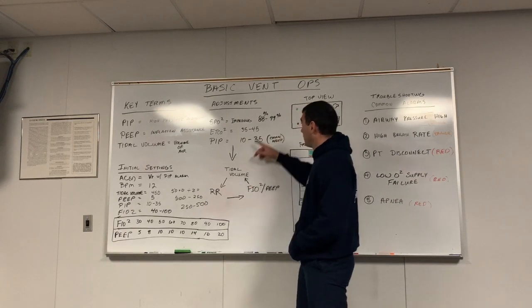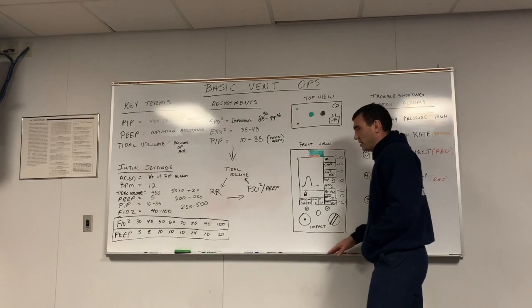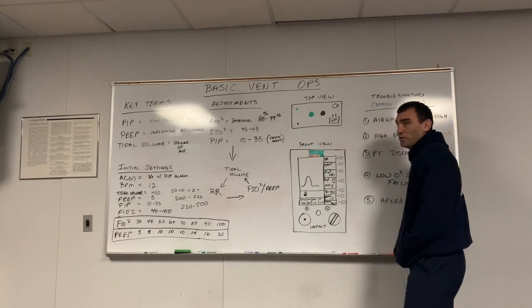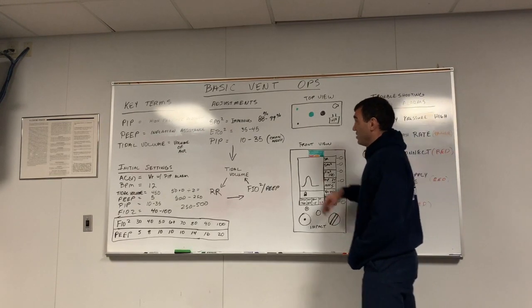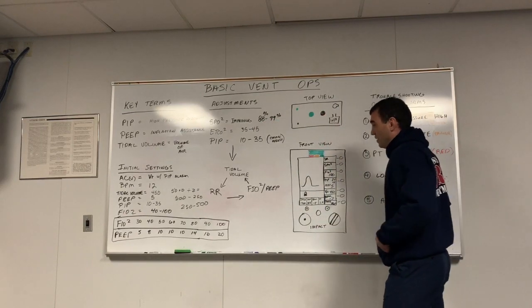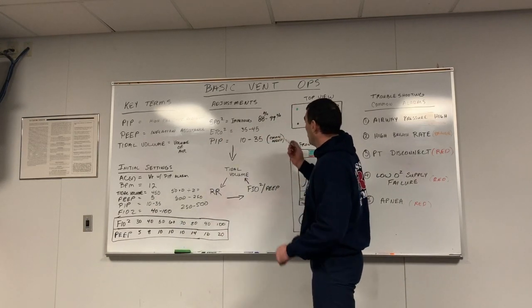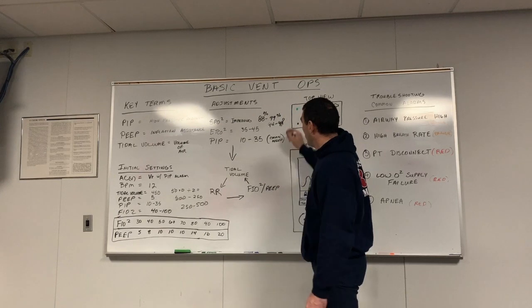Okay, so this says 88% to 99%. There. So what that goes for, generally we think of it as like 94 to 100 or 94 to 99. Okay, what the 88% for is if you have a patient that lives at that level normally, you have severe COPD, okay, or somebody that's been down for a long time with COPD, and you can't make them get any higher, they probably live at that number, okay, and they're going to be okay. 88 is the low end, okay? Generally, what most people are looking for is somewhere between 94 and 99, okay? Somewhere between 94 and 99, right?